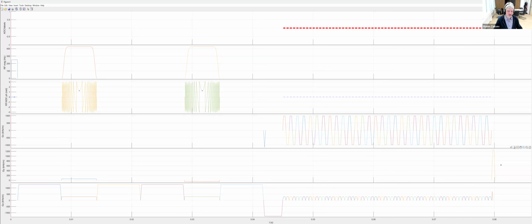Yes. So I have two things for you. One is, yes, it's certainly possible. We have this concept of blocks, and one block follows another and they touch each other always. There are no gaps between the blocks, no delays or whatever.